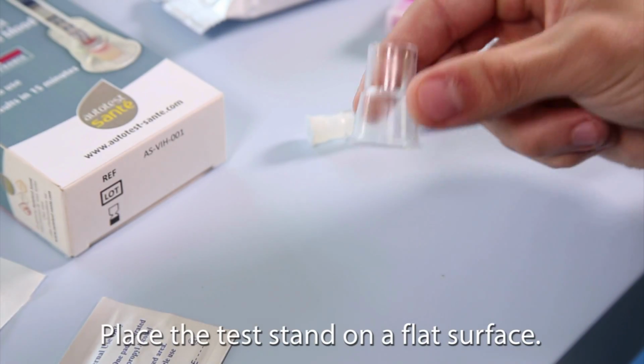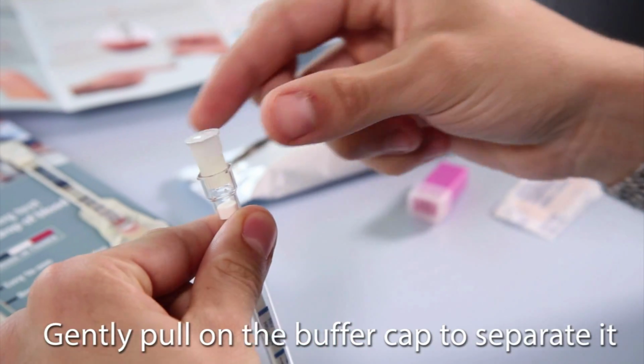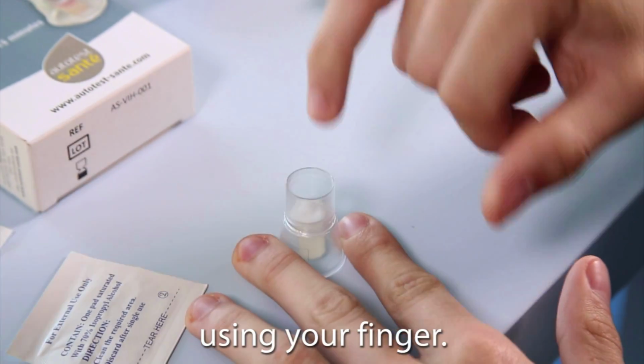Place the test stand on a flat surface. Gently pull on the buffer cap to separate it from the top of the testing device. Drop it into the bottom of the test stand using your finger.